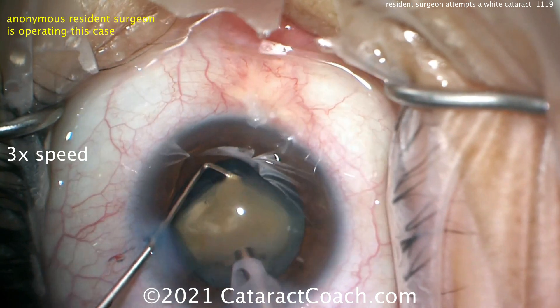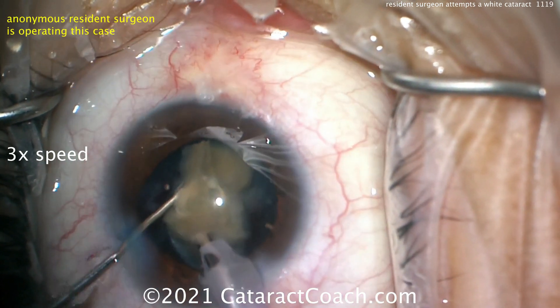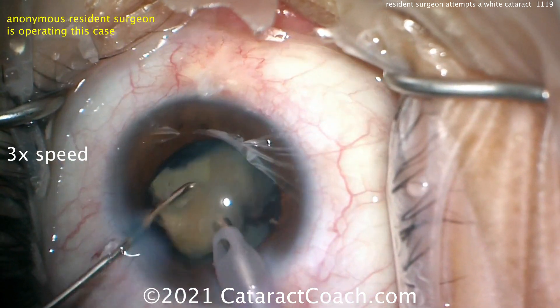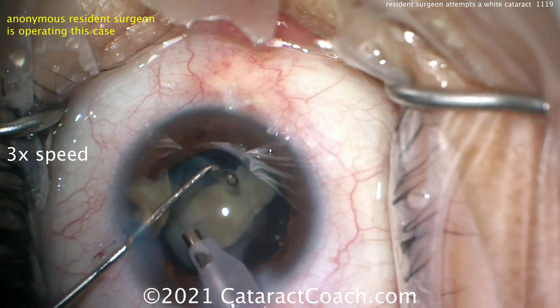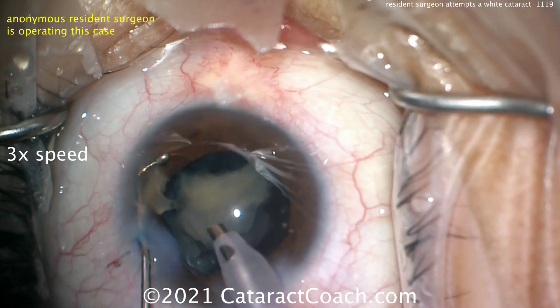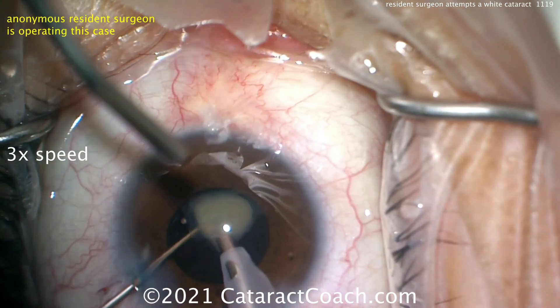This is an odd chopper — not my favorite. That ball tip on the chopper gives you a false sense of security and makes your chopping less efficient. You don't want a ball-tip chopper, at least not in my view. But this young doctor is doing a great job — still using that chopper and getting these pieces out beautifully.